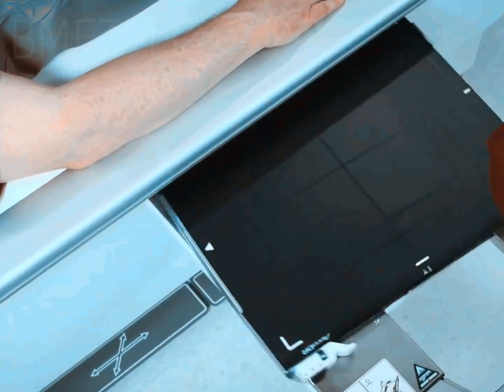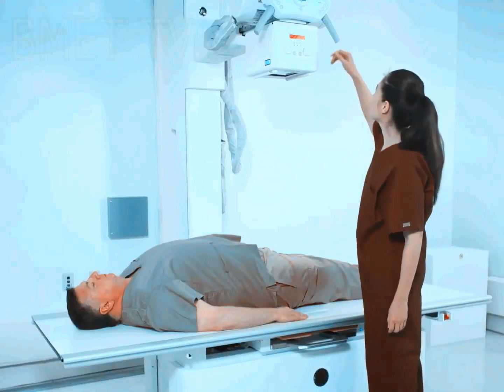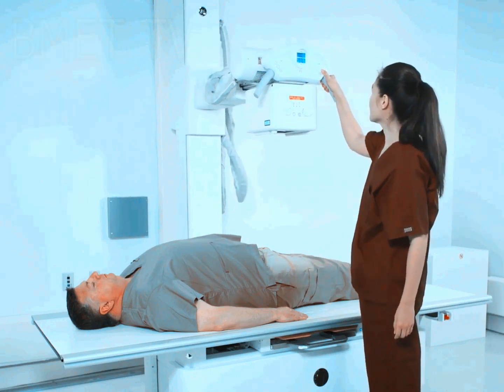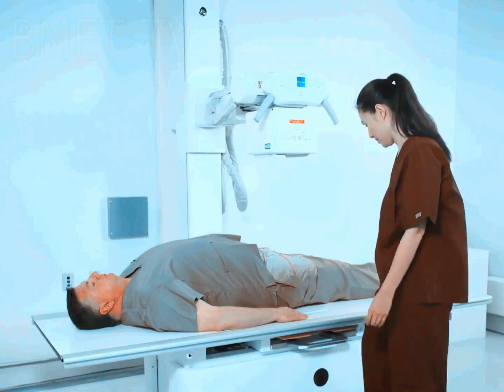There is nothing special about a bucky grid other than its size. A reciprocating bucky is a device that moves the grid while the X-ray is being taken. The motion keeps the lead strips from being seen on the image. The finer the lead strips, the less movement is needed.